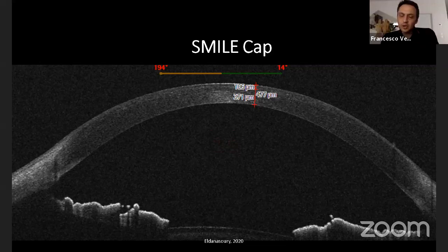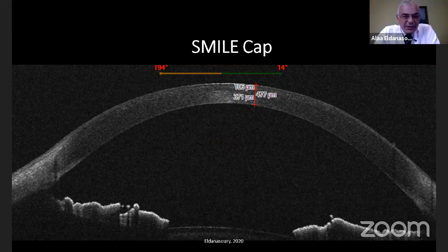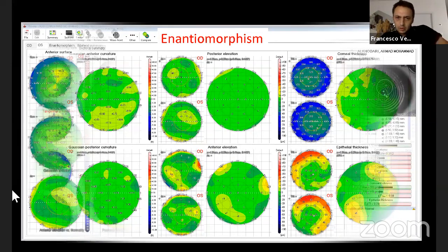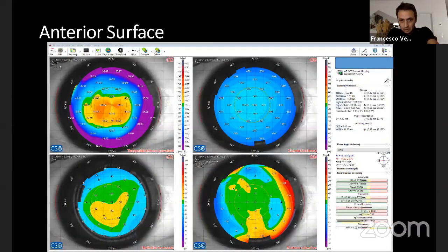So I'm going back, just stop me. The very first case you showed, the one with the anterior steepening, which was the fellow eye of a keratoconus. I think it is this one. My impression, and I ask for confirmation, was that this could be a very peripheral ectasia. As you can see, the posterior floating is rising in the inferior part, but since it's very peripheral, we cannot see it in the way we are used to seeing keratoconic eyes, just because it's very inferior.